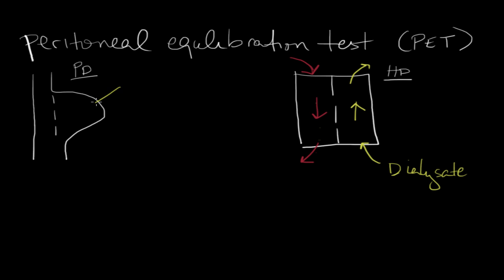In peritoneal dialysis, you infuse some dialysate into the abdomen and you let it sit there. And it has to sit there, because if you were changing dialysate minute by minute, this would be an untenable form of dialysis for any patient. So you have to let the dialysate sit here. But you know that as you let dialysate percolate in the peritoneal space, you're going to have a diminished rate of solute clearance. So I'm going to denote solute clearance here in the pink color. So you have solutes coming out, some by diffusion and some by convection, but the concentration of those solutes in the dialysate increases as time elapses.